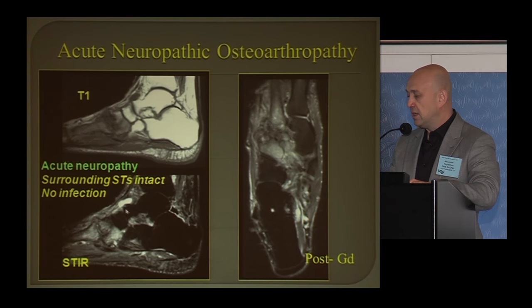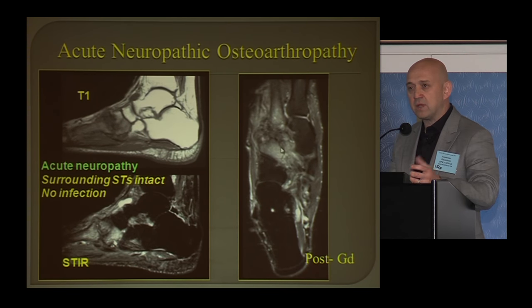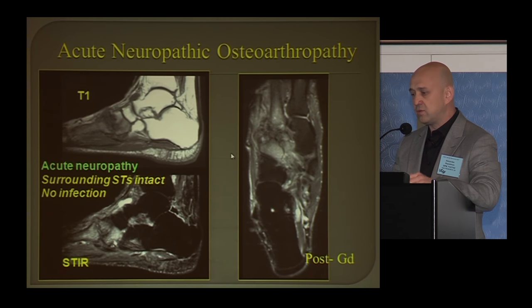That's abnormal. And when you look at this view, this is a T2 image, the bone should be black, and yet the tarsal metatarsals are lit up or have a high signal intensity. And same thing here, this is abnormal. So this could be read as osteomyelitis, but yet this is Charcot arthropathy and has nothing to do with osteo.